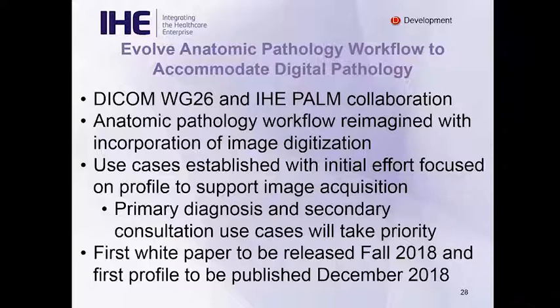DICOM Working Group 26 has been working at this for a long time to create a standard file format and metadata and data elements that are necessary to support the digital pathology workflow. DICOM Working Group 26 is helping us to move forward our profile development relative to digital pathology, and we have very strong collaboration.